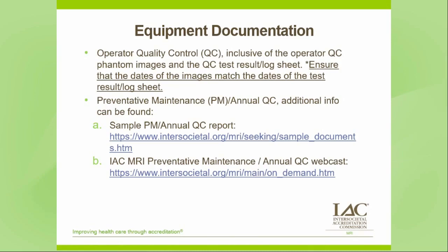The most common deficiency regarding operator QC is that the dates of the QC phantom images don't match the dates of the QC test results log sheet. And this happens because sometimes a couple weeks may have passed between the uploading of the QC test results log sheet and the request for images.